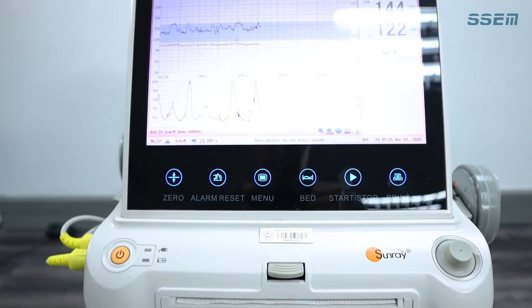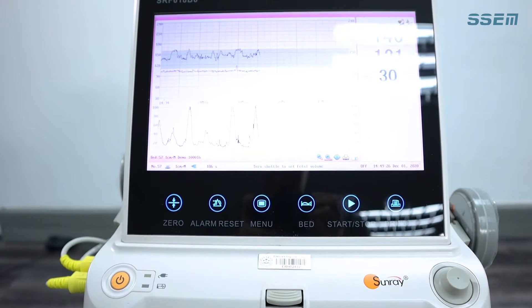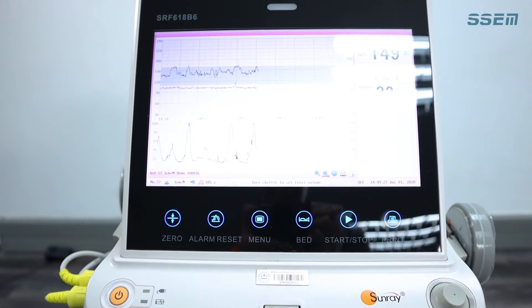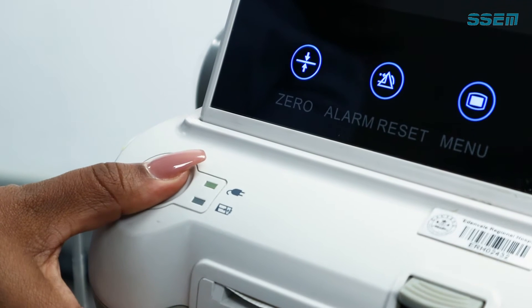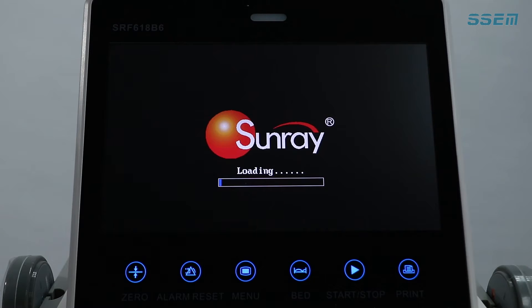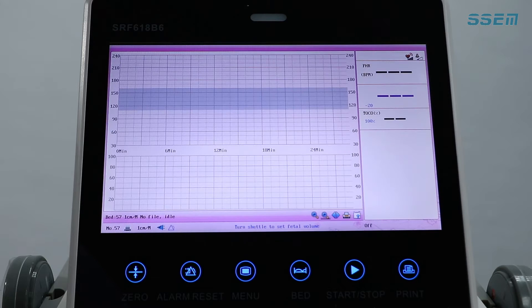The sequence to follow when doing a Cardiotocograph on a Sunray B6 device is as follows. Switch on the device. Note that the device will perform a self-test. Once passed, the main screen will display.